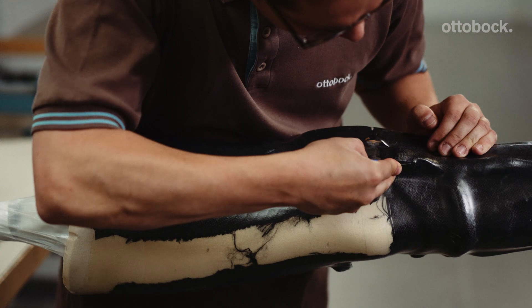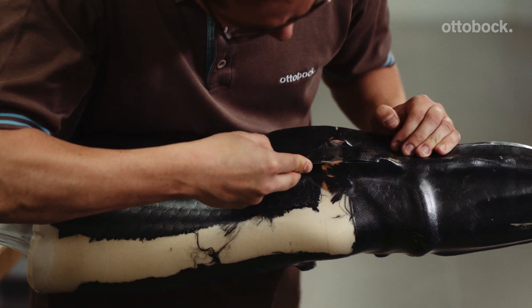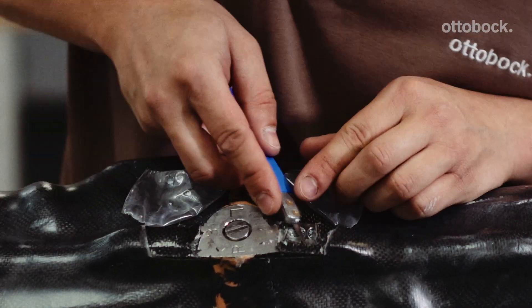Next, remove all the screws from the medial support dummy. In some cases, you may need a saw to expose the dummy.